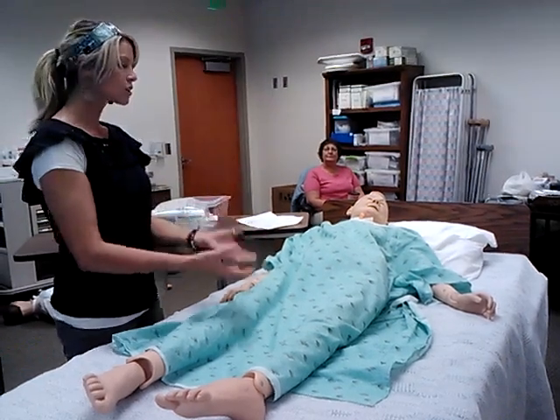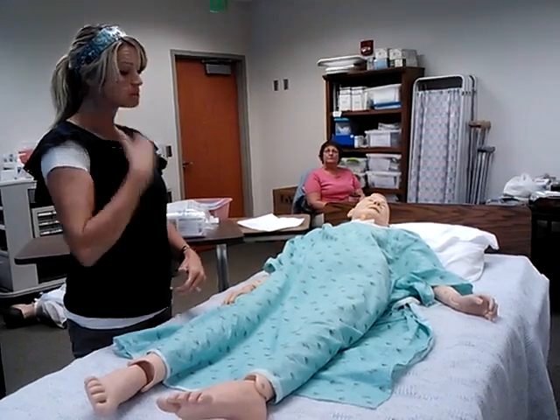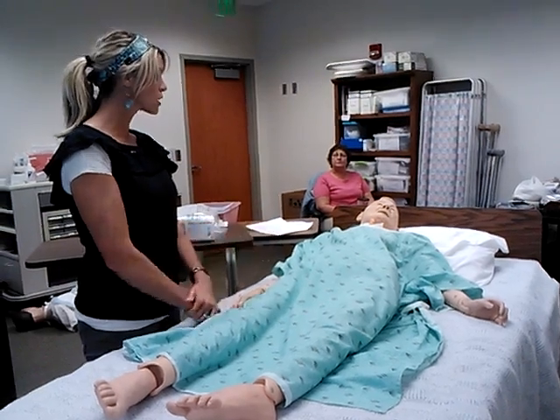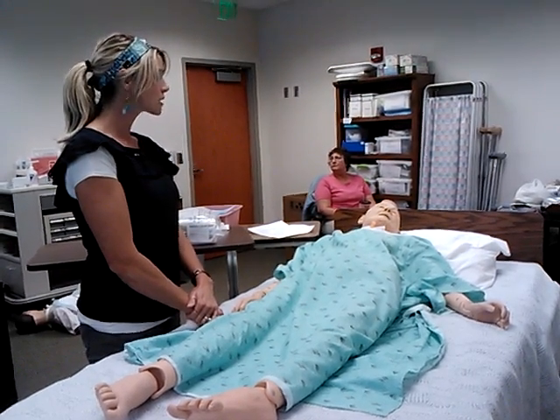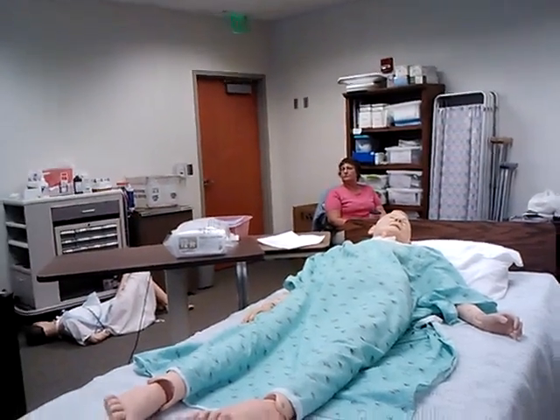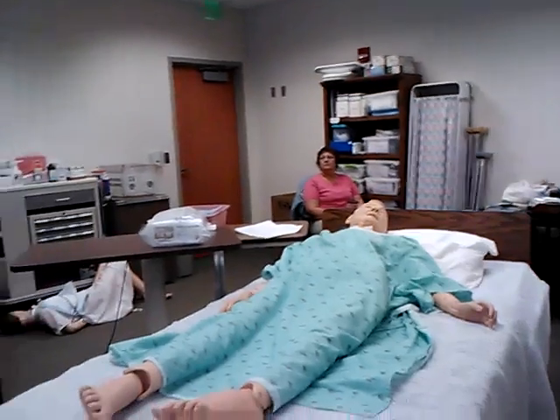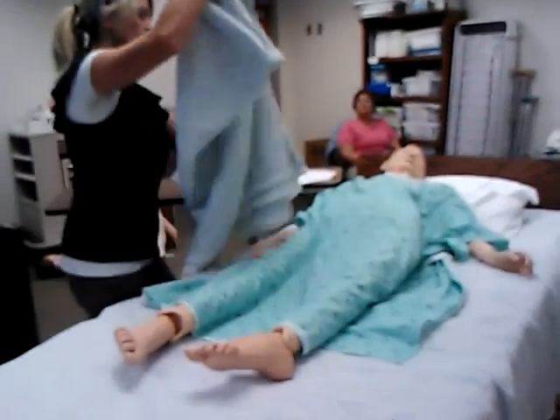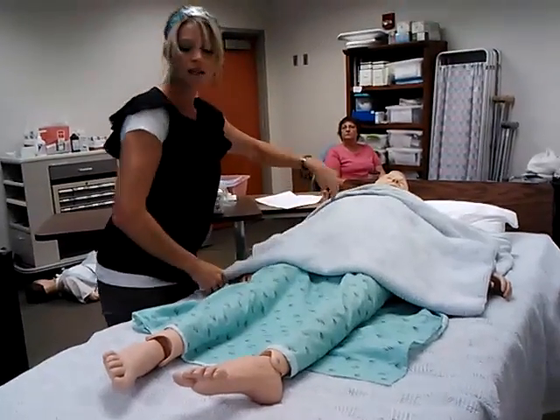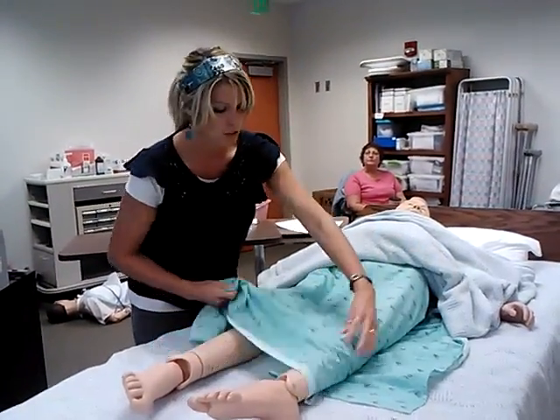So you're going to explain that you're going to have to lift his legs up, or her legs up, and get him in a position. And that it'll be kind of cold for a second and a little bit uncomfortable. So you get a blanket, which is right here. And I usually blanket the part that we're not going to be touching, which is usually up here, so that they can stay a little bit warm. Okay?